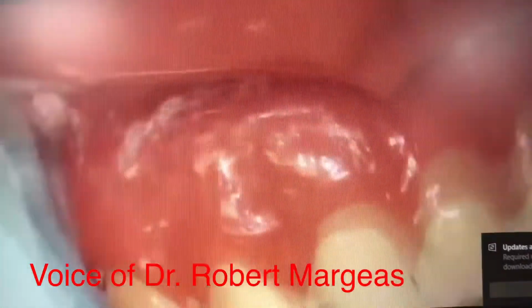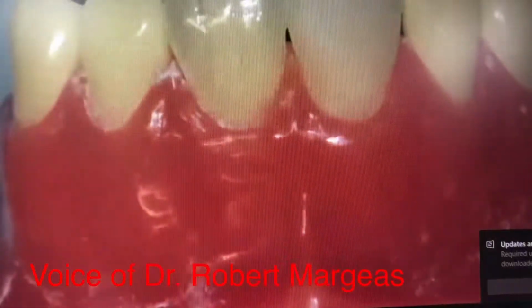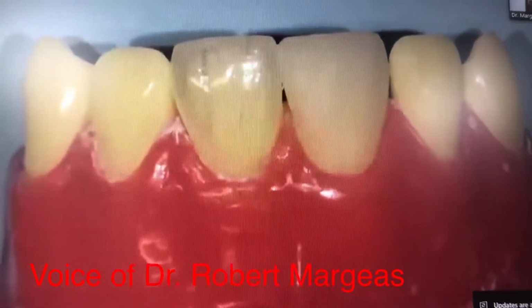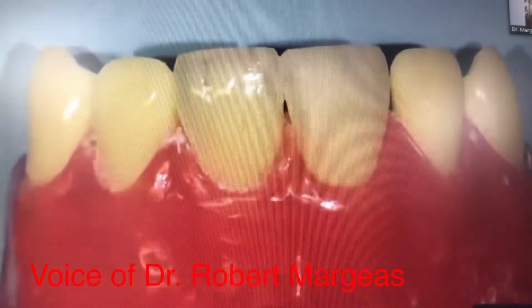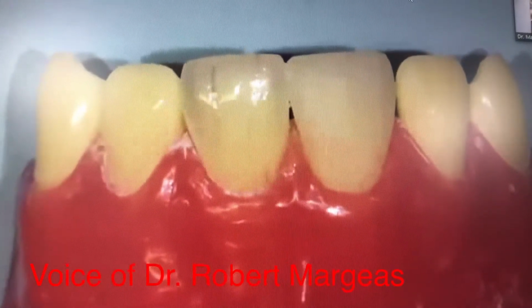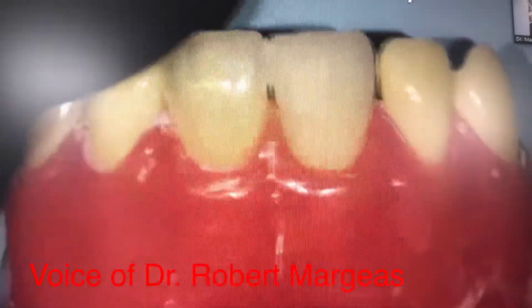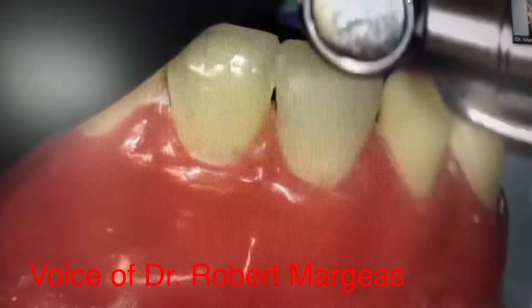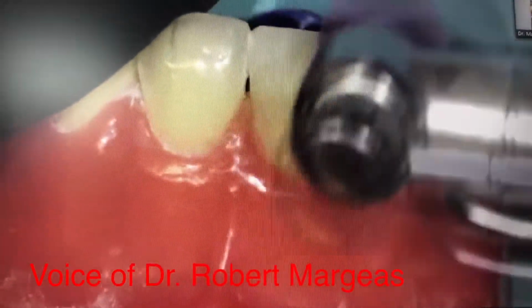Now, if that's all I have, I go right to my ASAP polisher. It's an all-surface access polisher. And these are the ASAP dailies. One is purple and one is peach color. So what I'm going to do is just come here and polish this restoration. I'm using quick strokes, low speed, around 6,000 to 8,000 RPMs.